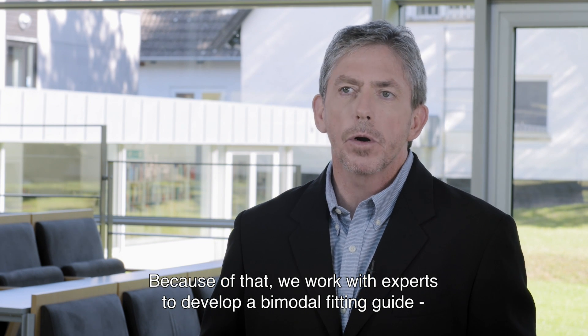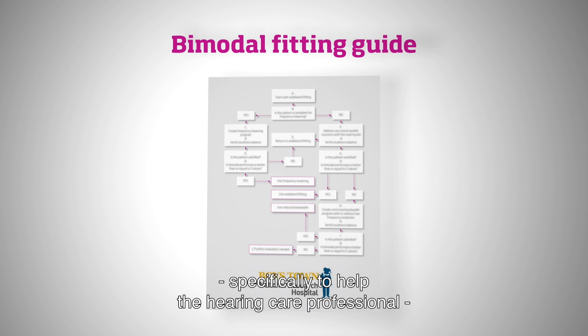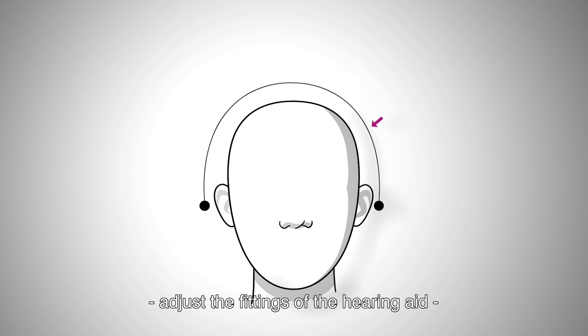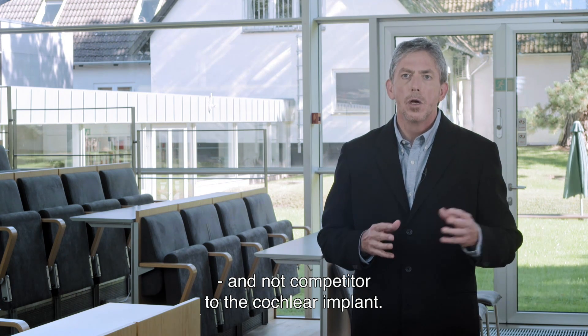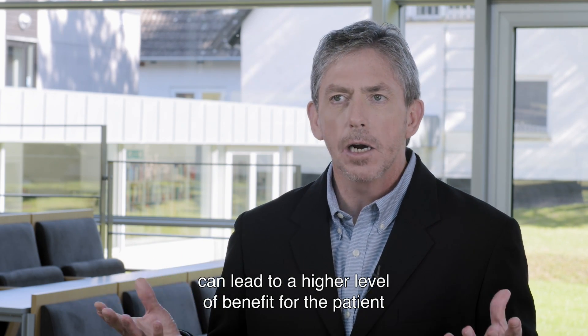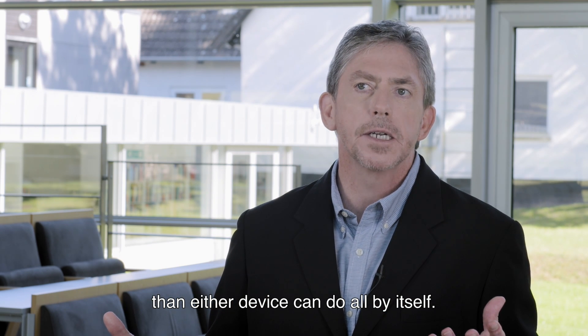Because of that, we've worked with experts in the field to develop a bimodal fitting guide specifically to help the hearing care professional adjust the fittings of the hearing aid to make sure that they take on this new role and act as a supplement and not competition to the cochlear implant. We believe that the two devices working together can lead to a higher level of benefit for the patient than either device can do all by itself.